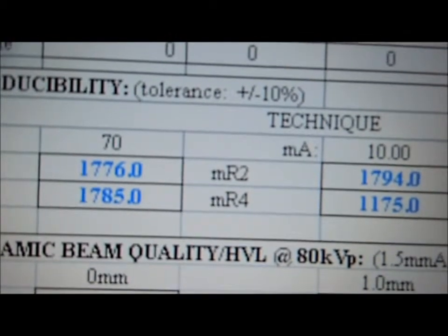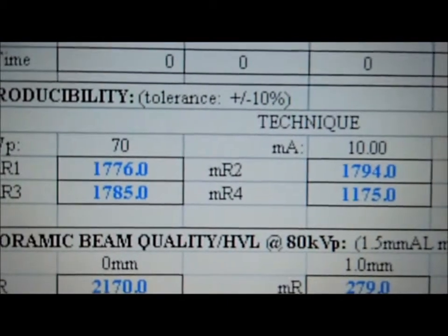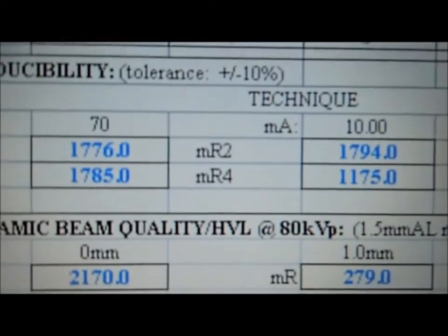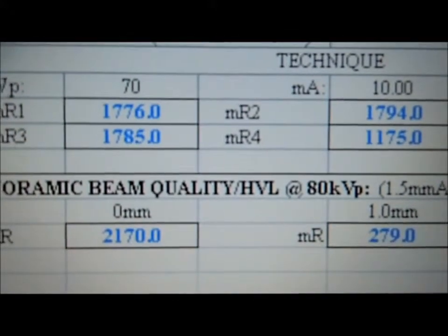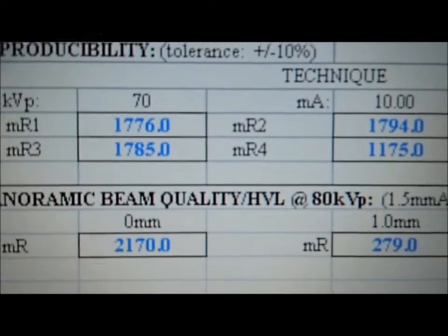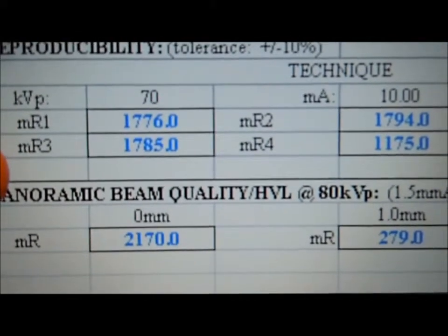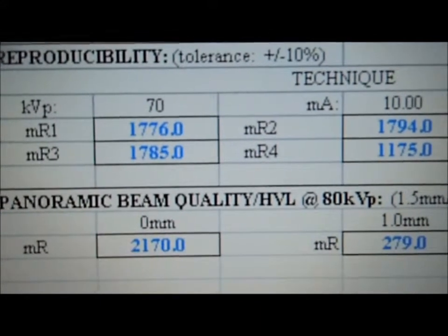A series of X-ray shots are then averaged together and measured. As shown here, we are taking 4 shots, but actually we're taking a series of 8 shots. We will take the first shot, then another shot, which is an in-between shot, and then take the shot and ensure the reproducibility, or the accuracy.